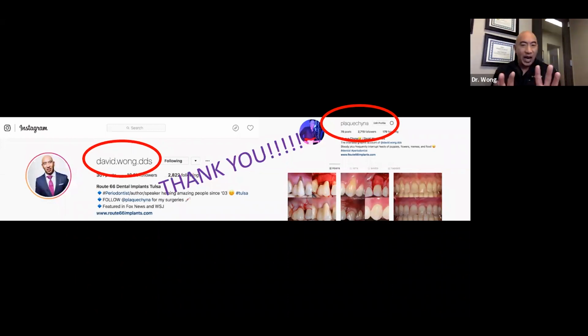Yeah. Okay. So that's actually an easy question to answer. Your membrane is on the inside of the socket. So when you're engaged, you always go through the labial side of the soft tissue first. The tip of your needle is going to actually hit the labial plate first, so you'll hit the labial plate and then slide on up. Your membrane's on the inside of the socket, so that should never be an issue. If for whatever reason it's still an issue, I couldn't imagine how, but if it is, what I would do is make your first bite more lateral, off to the mesial or the distal, so get away laterally from the membrane.